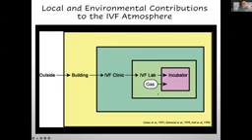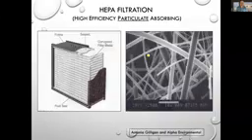All that together was published at the end of the 1990s. And so laboratory design slowly changed to accommodate these findings. One of the early proposals was, well, not all these laboratories have HEPA filtration. They should have HEPA filtration.